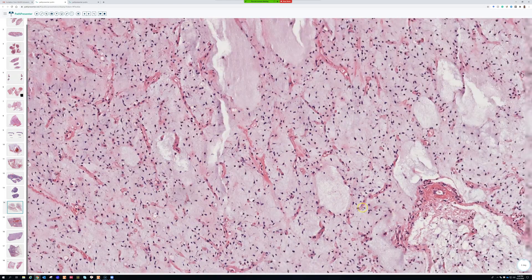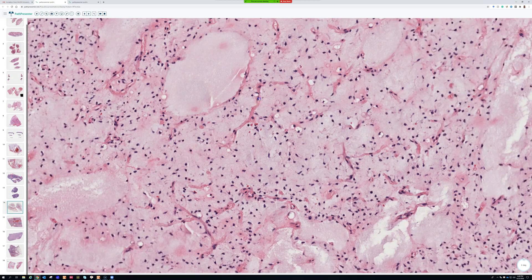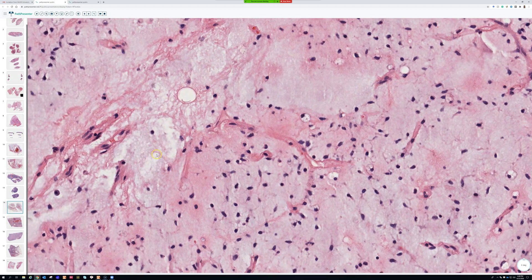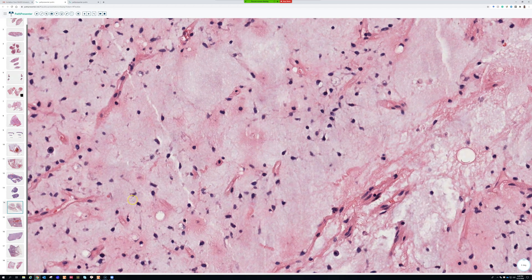The vessels of myxoid liposarcoma are the smallest, most delicate vessels you could possibly make. They are about one endothelial cell thick — they don't have a muscle wall around them. They are a single layer of endothelial cells. If you find ones with red cells in them, the red cells look like rouleaux formation, with only room for single-file red cells to pass through. That's the way I like to think of them.